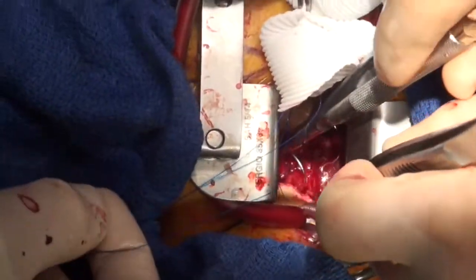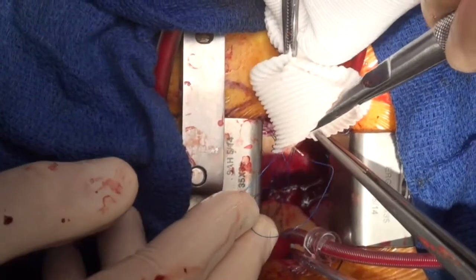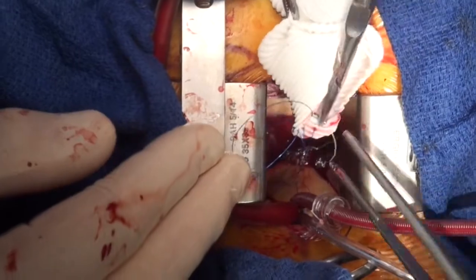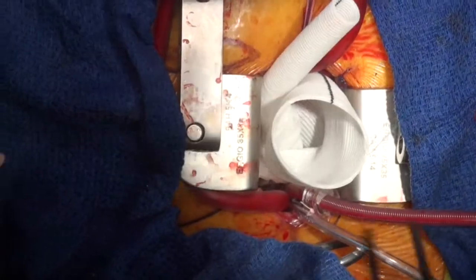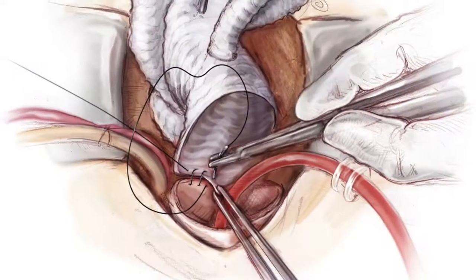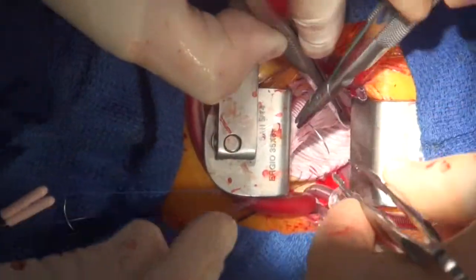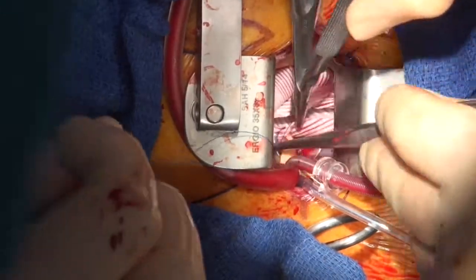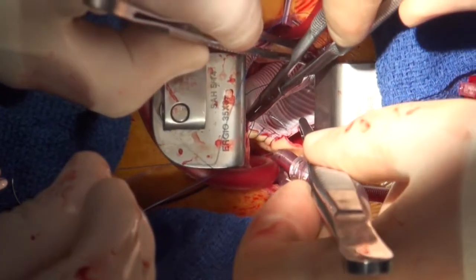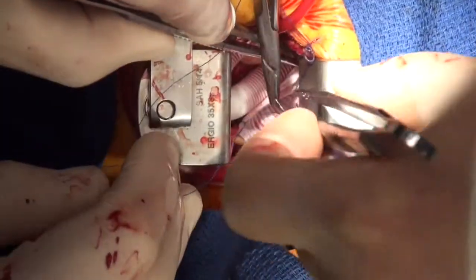We're going to perform the continuous suture on the back wall, and then parachute the graft down. One thing notable about Tristan's technique is how close together he performs his sutures. He's very efficient and quick, but also consistent and meticulous — not accepting any errors or tears — which is key to preventing bleeding post-operatively.